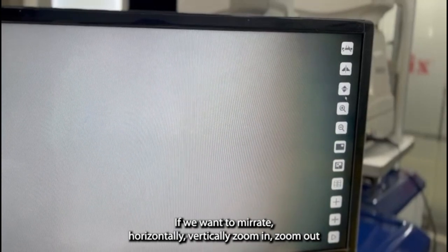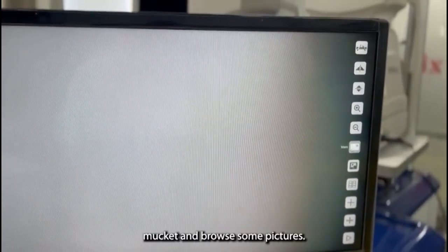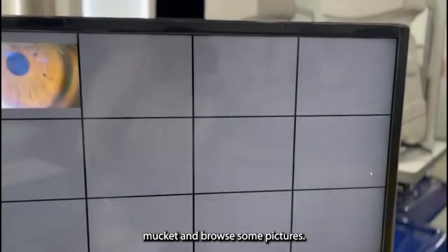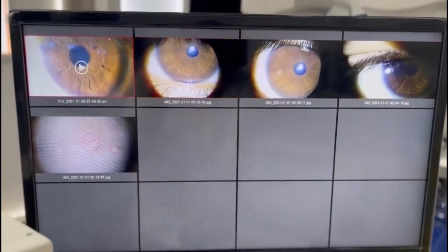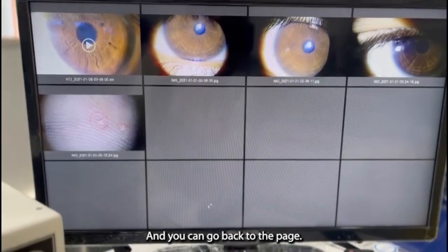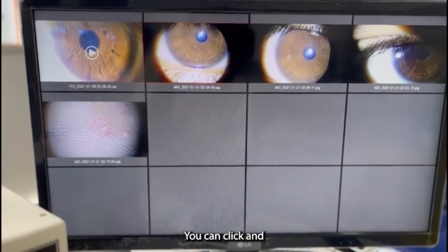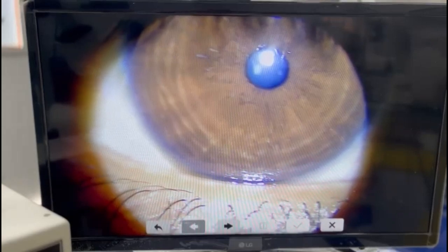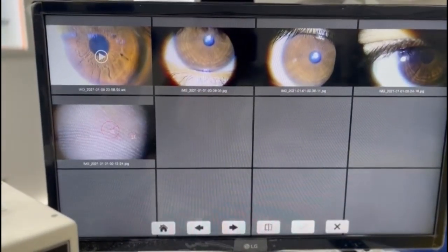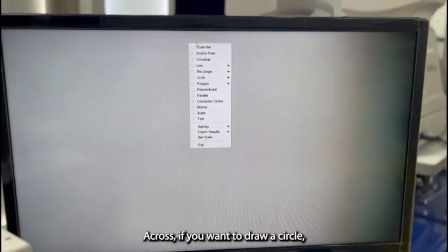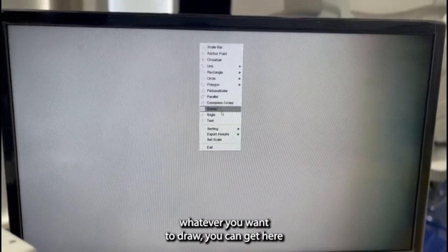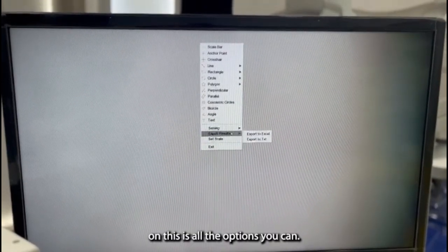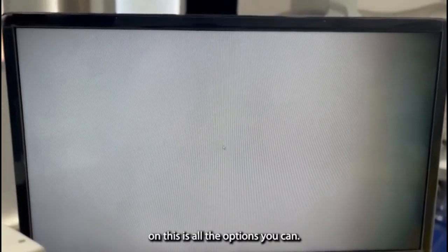you want to mirror it horizontally or vertically, you can mask it and browse some pictures, as you can see, which I clicked a few minutes ago. You can go back to the home page, or you can click it and go back from here. If you want to delete, you can delete. First I want to return, and now I will freeze it. You can also get a ruler and cross line — if you want to draw a circle or whatever you want to draw, you can get here. These are all the options you get.